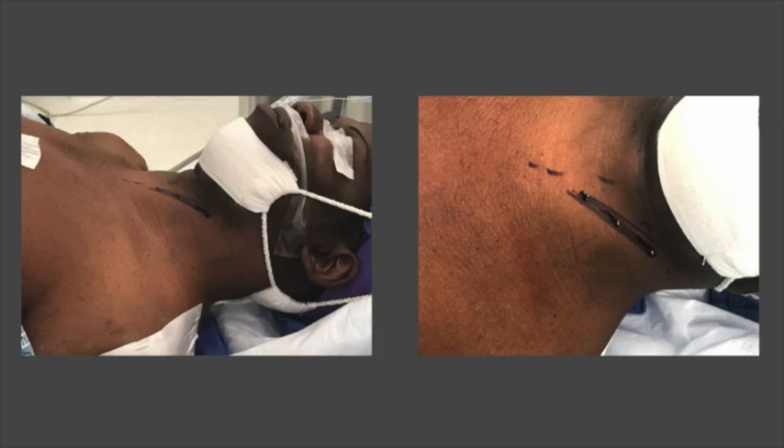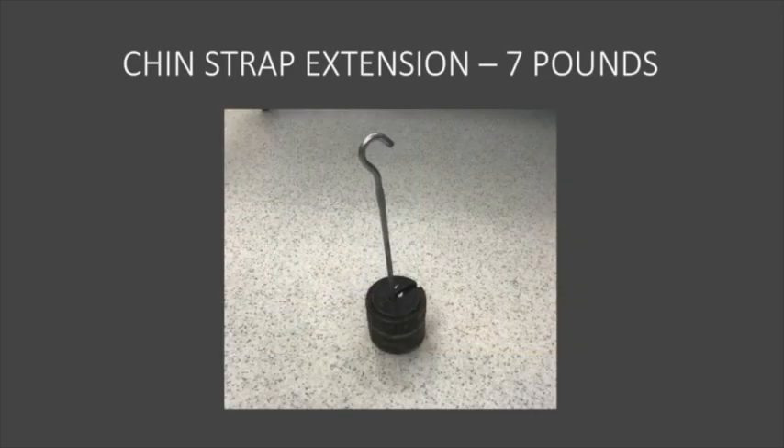The patient's operative position was supine. We placed a chin strap with traction of seven pounds of weight. We identified the midline and then the medial border of the left-sided sternocleidomastoid muscle. The skin incision was approximately two inches long. He was sterilely prepped and draped.